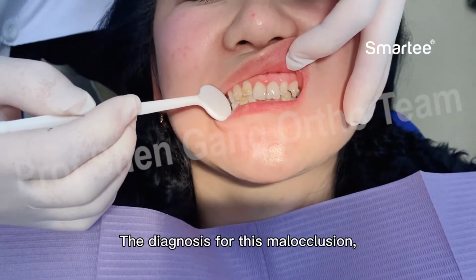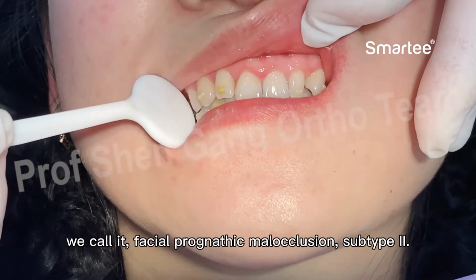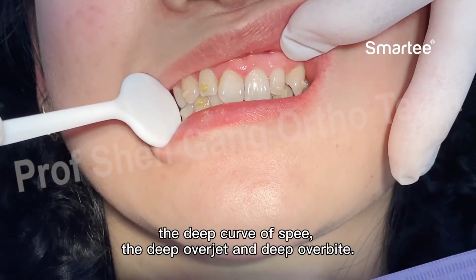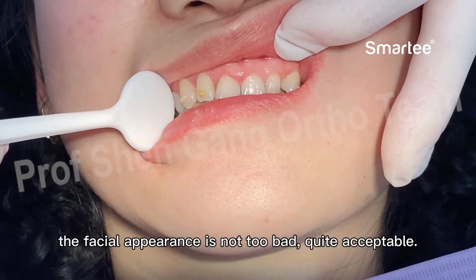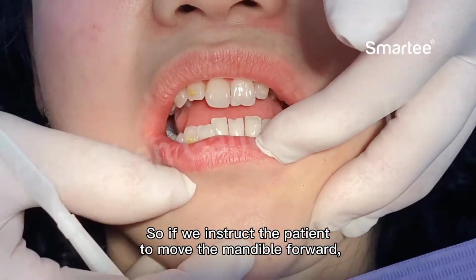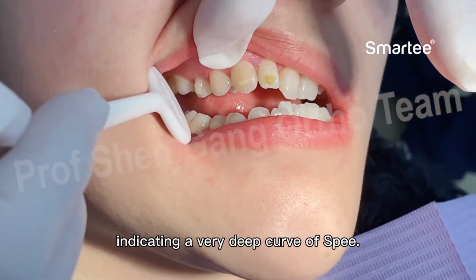The diagnosis for this malocclusion, we call it facial retrognathic malocclusion subtype 2. The characteristics include the deep curve of Spee, the deep overjet, deep overbite, and the retroclined frontal teeth. Facial appearance is not too bad, quite acceptable. So if we instruct the patient to move the mandible forward, we see quite a big space in the buccal segment, indicating the very deep curve of Spee.